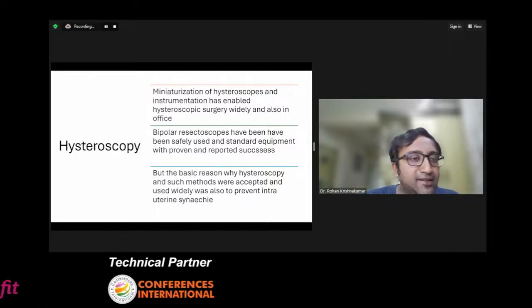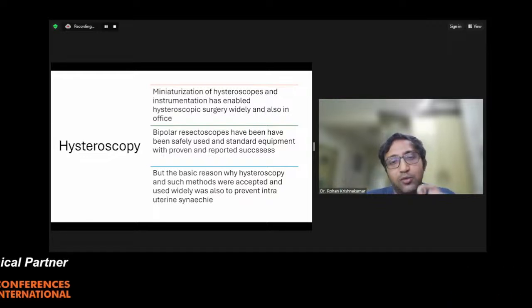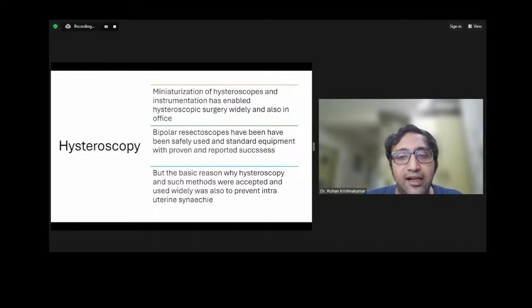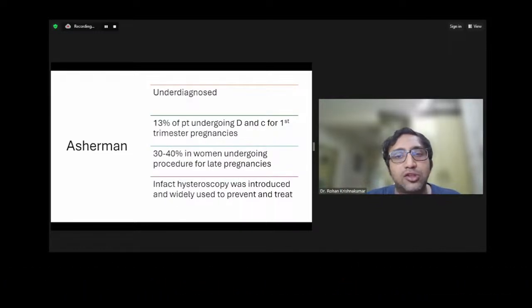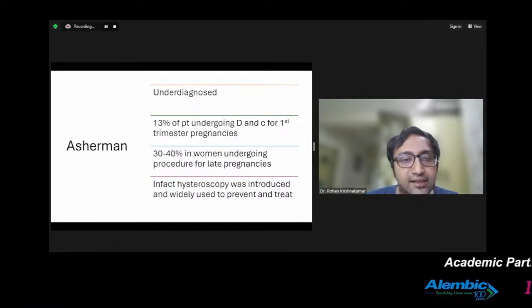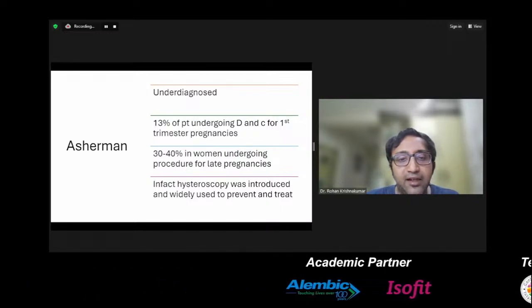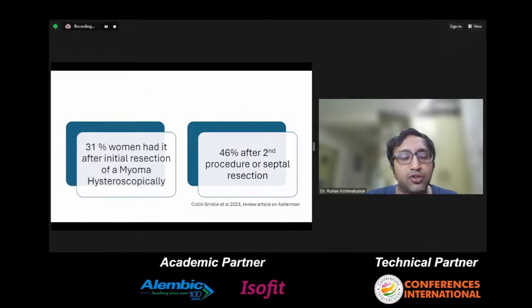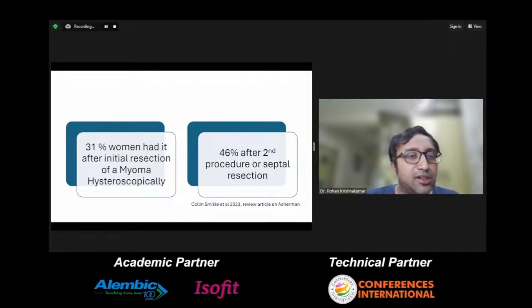We all moved from D&C to hysteroscopy to prevent uterine synechiae, that is adhesions, and hysteroscopes became more and more miniature so that we can use them more easily without dilatation, without losing the virgin view. With Asherman's, we found that almost 13% of patients undergoing D&C for first trimester pregnancies are prone to it. In late pregnancies, incidence is almost 30 to 40%. In fact, hysteroscopy, as I said, was introduced to widely prevent and treat this, but unfortunately that's not happening. We still see Asherman's after hysteroscopic procedures.